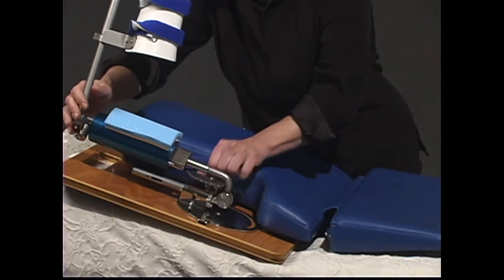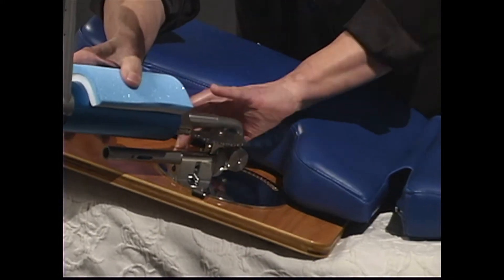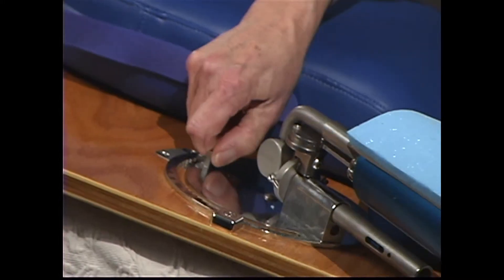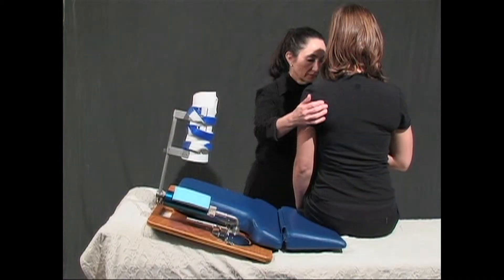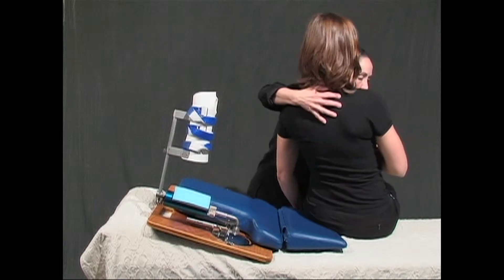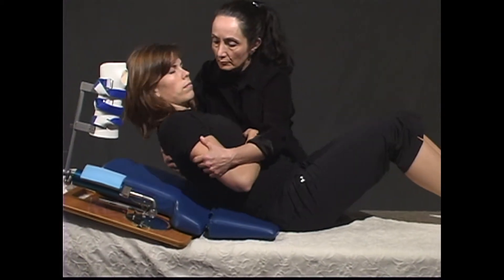Reach for the pivot point at the shoulder axis and press the pin in to let the unit swing to the side and rotate back up to allow room for the patient to lie down. Position the patient with their thigh sitting on the blue cushion, then turn the patient and help them to a supine position.